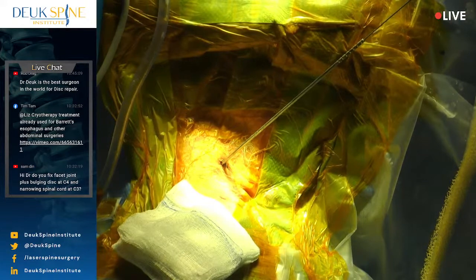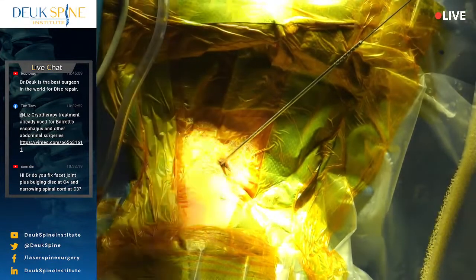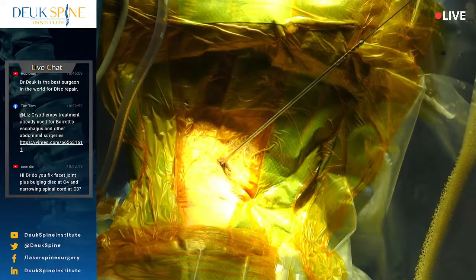Okie dokie. There's the dilator tip at the back of the disc. Perfect. You can see that the back of the vertebral body of six is slightly rotated. So I need Monica to fix that just a little bit with her orbit. I would drop your side just a degree. It's no more than a degree. Let's see where that is. That's it. We fixed it. Now the shoulder's gotten in the way.